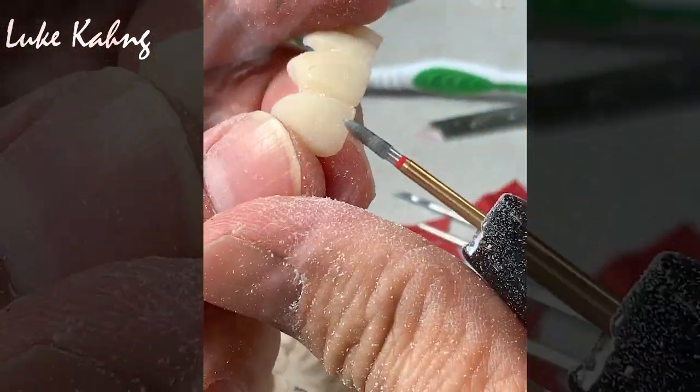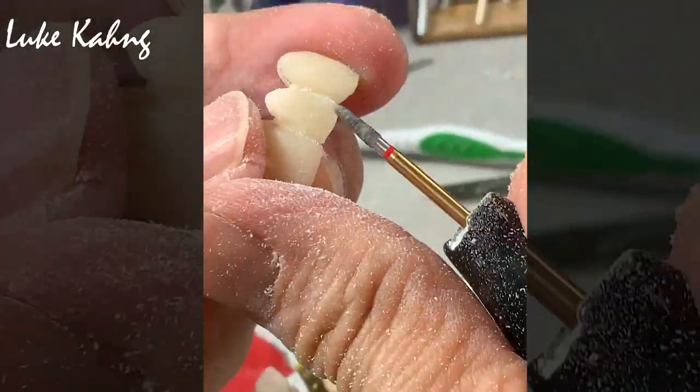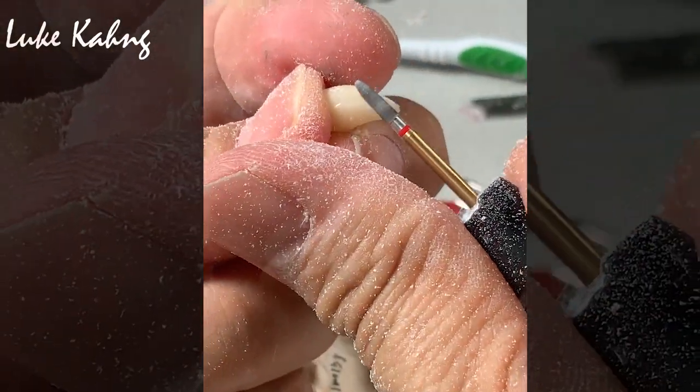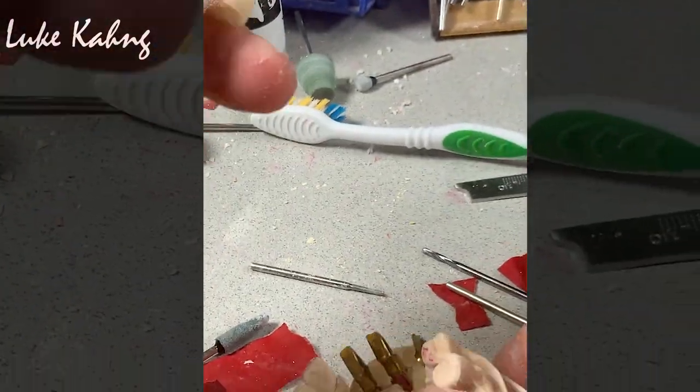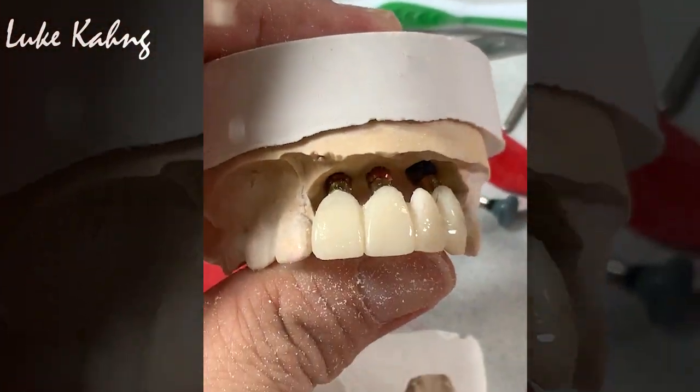And then the patient can hold it 3 to 6 months, until they heal, and then we're really going to make the new fabrications, right? So this is another technique.